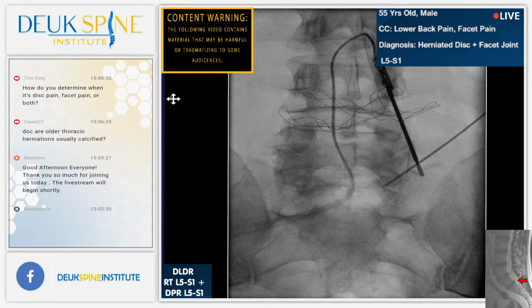Next will be his disc. Let me know when he's awake.